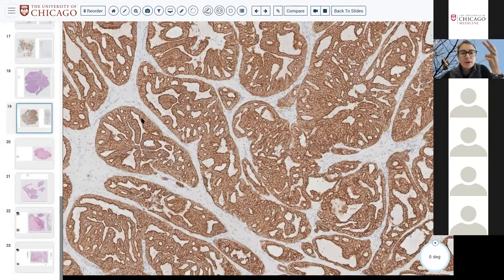So remember, you have salivary glands all over your aerodigestive tract. So don't ever forget, number one, that you can get a salivary gland type adenocarcinoma anywhere in the upper aerodigestive tract. In the sinonasal cavity, you could get intestinal type, which we've seen, and you can get non-intestinal type, which in fact is this, okay?